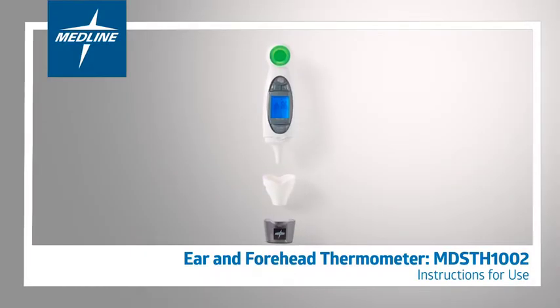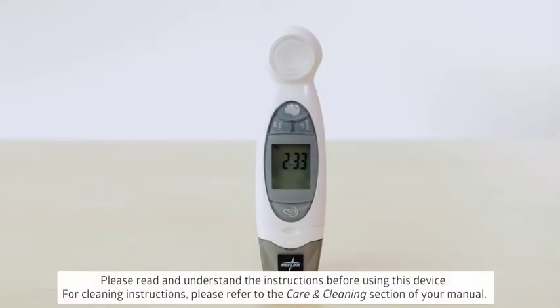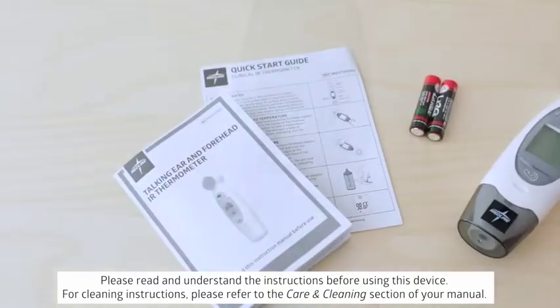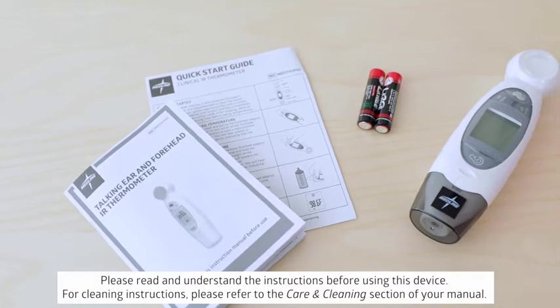Welcome to the Quick Start Video Guide for Medline's Ear and Forehead Thermometer Model MDS-TH1002. This thermometer comes with a quick start guide, a manual, and two AAA batteries.